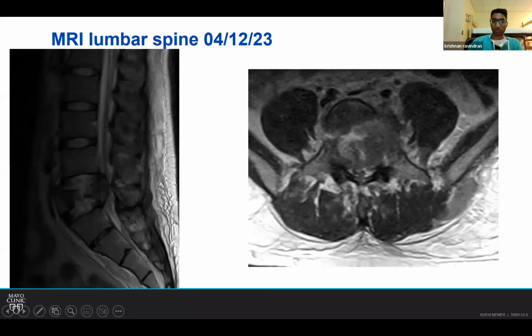Are you able to tell us what you see at all? Yes. So I see portions of the bone and fracture going into the spinal canal. Yep. So that's in the sagittal view. Sorry, that's a sagittal lumbar sacrum T2 MRI.